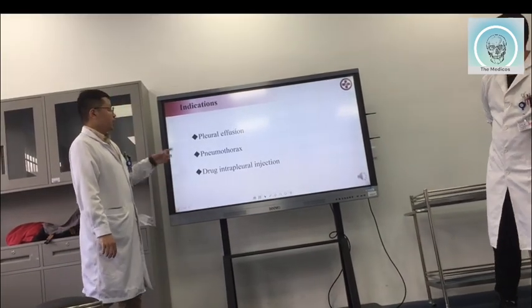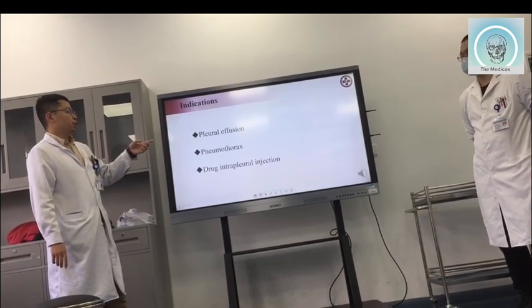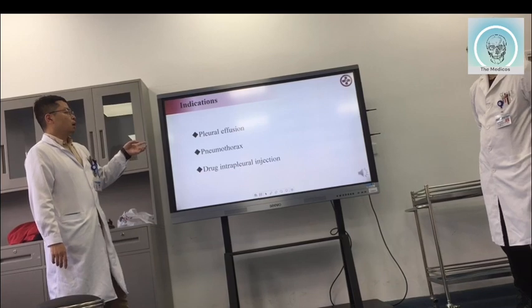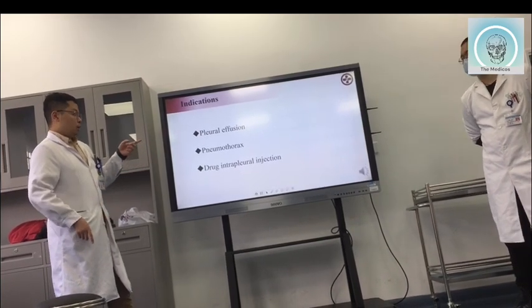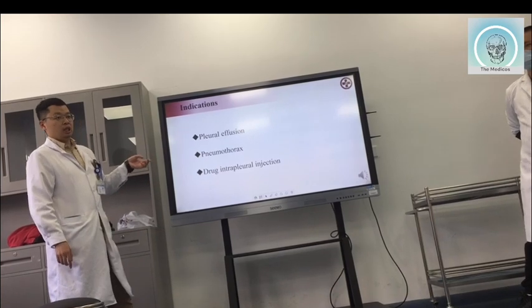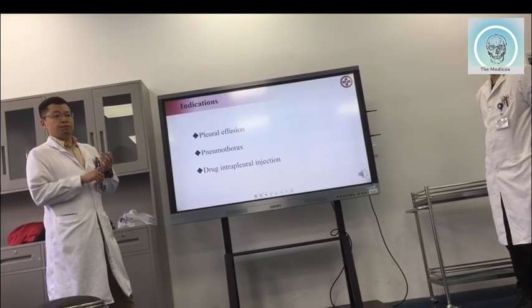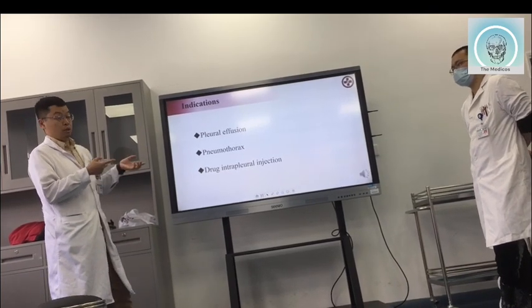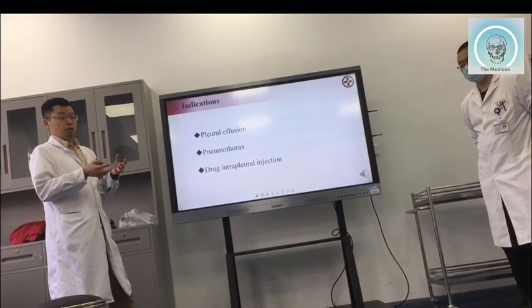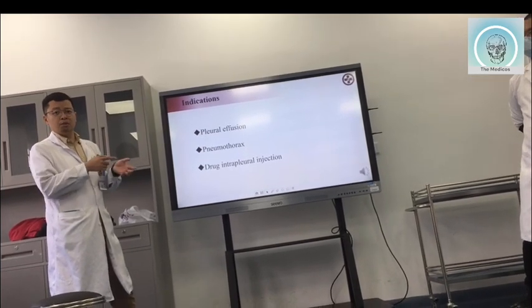So indications I've already told you. The pleural effusion, the pneumothorax, and also sometimes we use this kind of procedure to inject the drug inside of the chest cavity, sometimes for the metastasis of the lung cancer. Okay, then we will do this kind of procedure to inject some kind of chemotherapy inside the chest cavity.